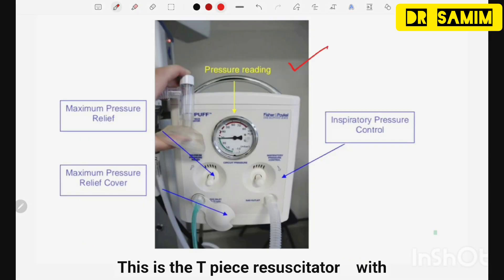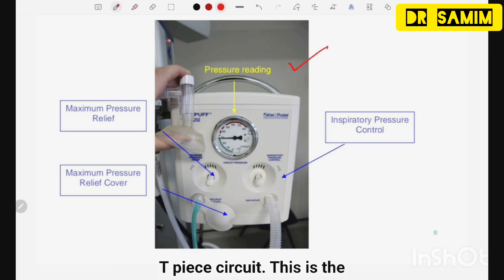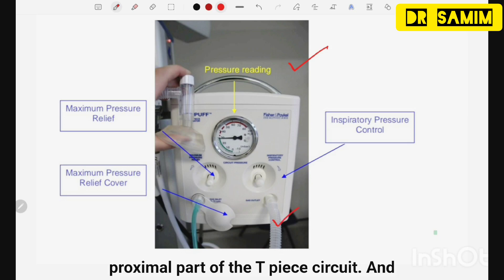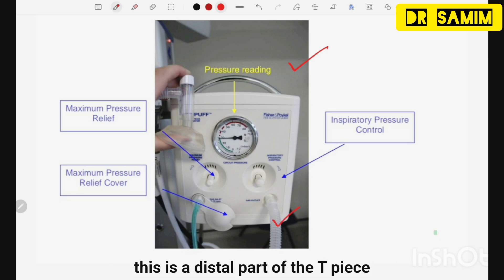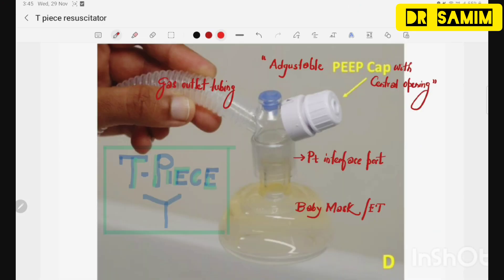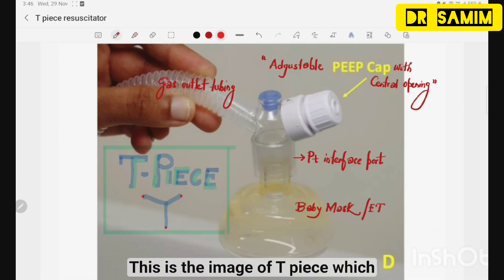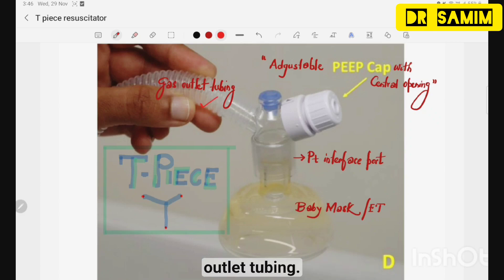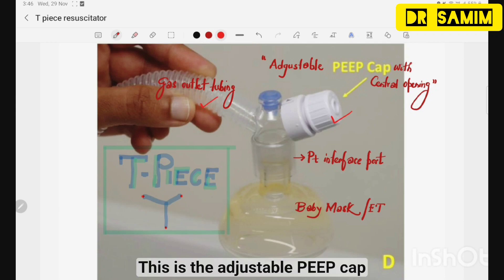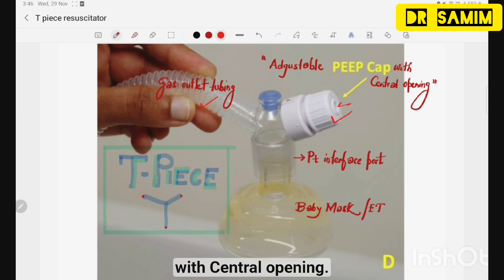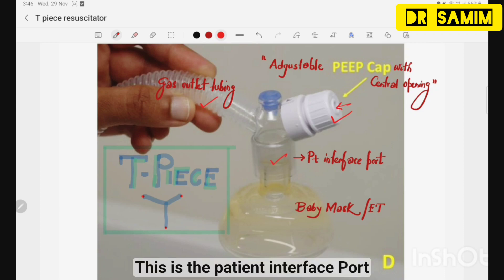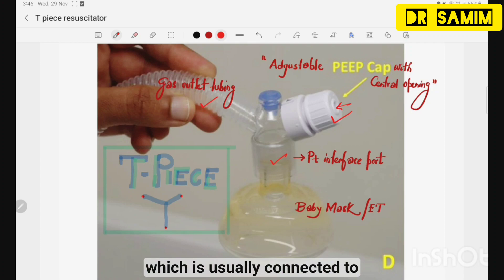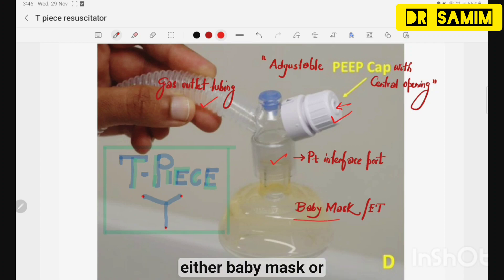This is the T-piece resuscitator with the T-piece circuit. This is the proximal part of the T-piece circuit and this is the distal part. The T-piece circuit has three parts: the gas outlet tubing, the adjustable PEEP cap with central opening, and the patient interface port, which is usually connected to either a baby mask or an endotracheal tube.